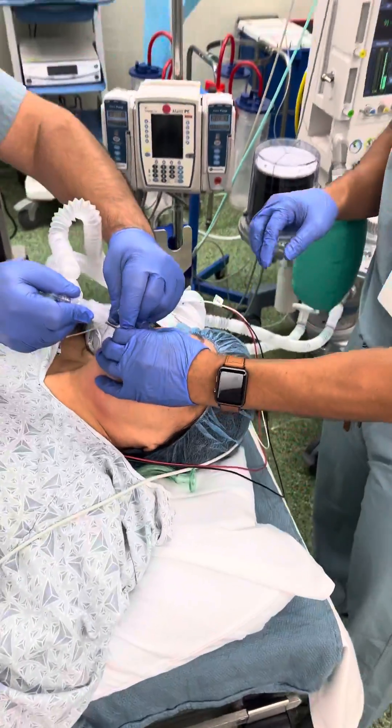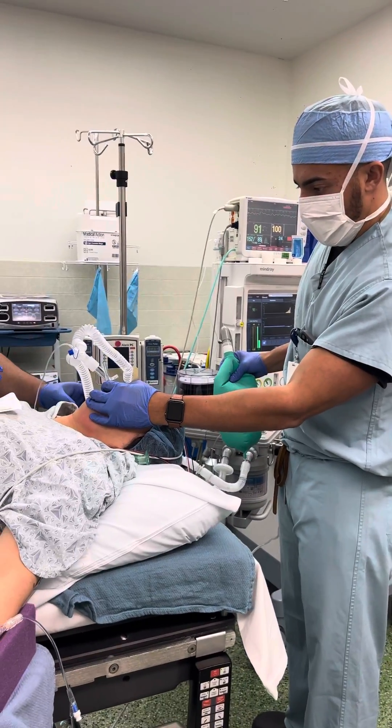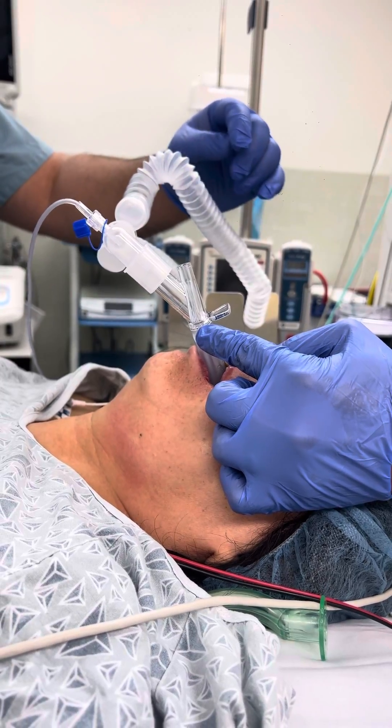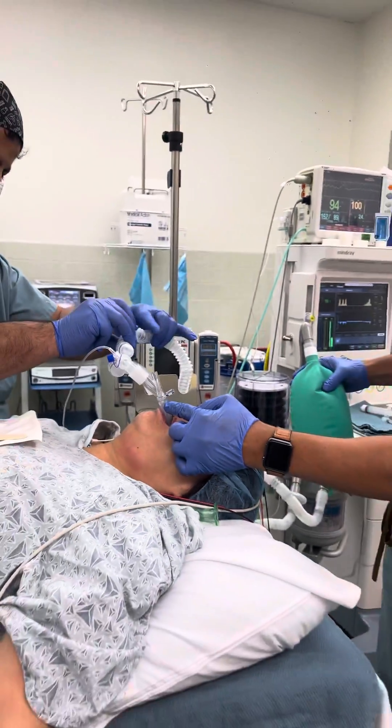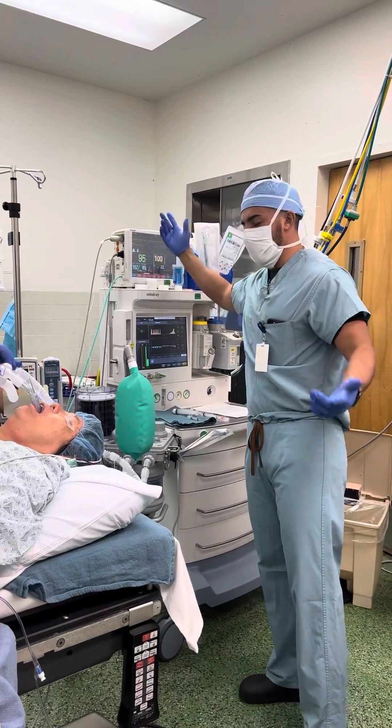We'll connect. You can see — I'm looking for fog right here. And we have it. Bellows look good, I see CO2. We have CO2 on the capnograph. We're good to go. You can cut the video.